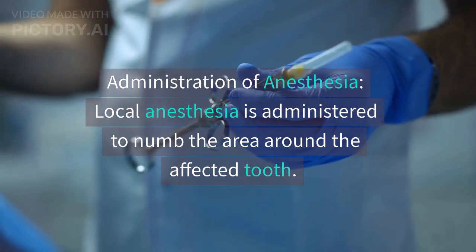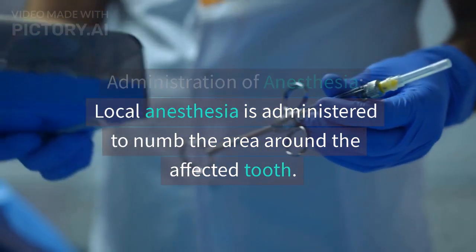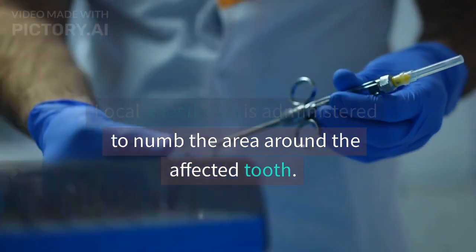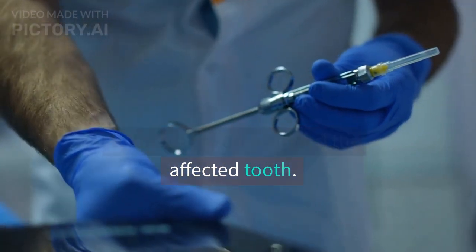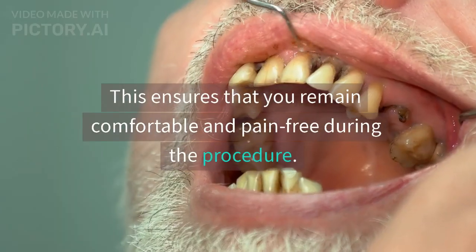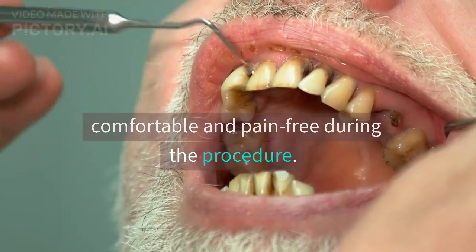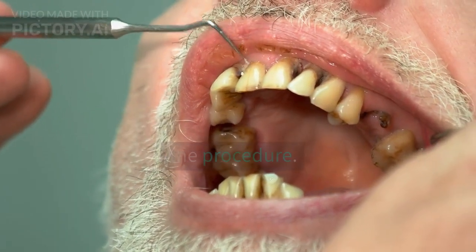Administration of anesthesia. Local anesthesia is administered to numb the area around the affected tooth. This ensures that you remain comfortable and pain-free during the procedure.